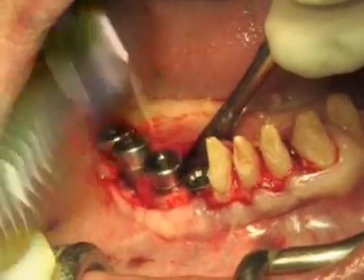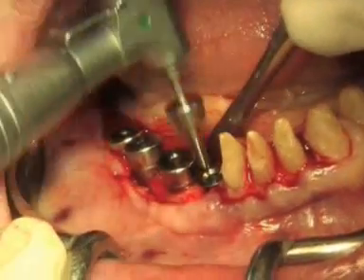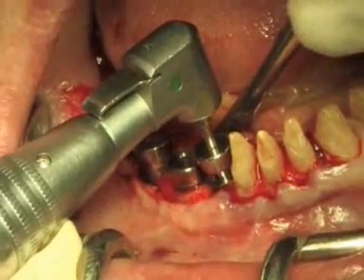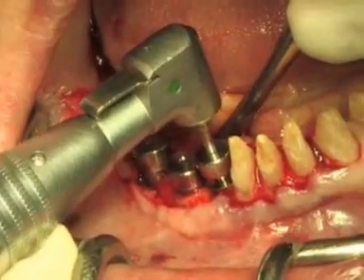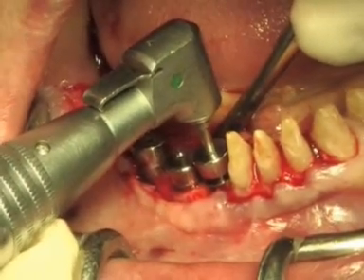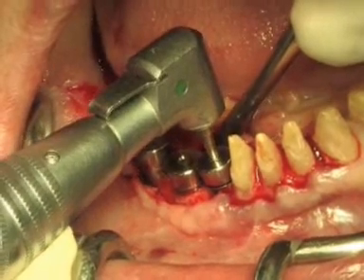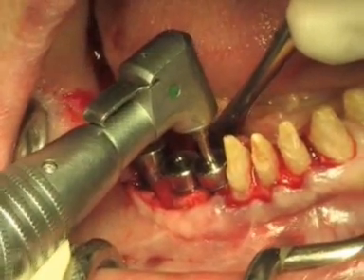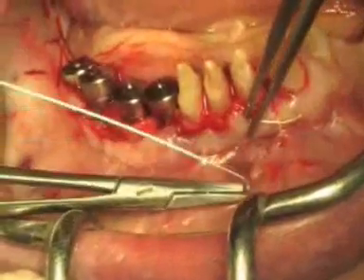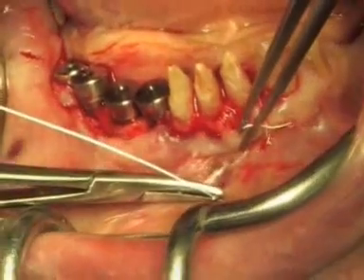There will be healing at the level of the bone margin, second intention healing, with coronal migration, which can't be exactly quantified but will certainly occur. At the level of the implants, the opposite occurs. The simple interrupted sutures can be seen which will take the margin coronally. So the gingival margin will be positioned around the implants decidedly more coronal with respect to the gingival margin at the level of the natural teeth.